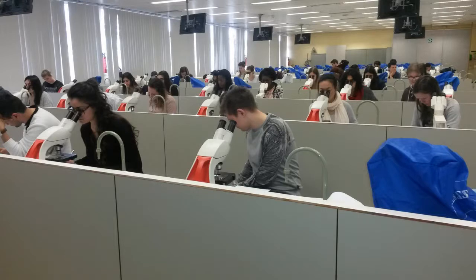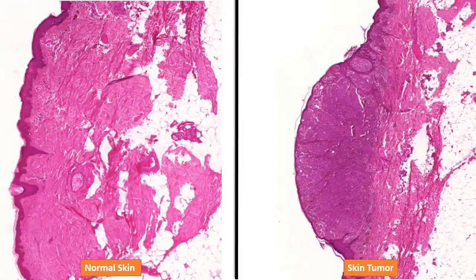Do you work at an educational institution with a medical dimension? If so, several groups of students at your location probably take up histology at some point of their curriculum. If you work at a medical school, chances are that pathology is taught at your school as well. Histology is the study of normal tissue structures. Pathology is the study of the diseased state of the same structure.